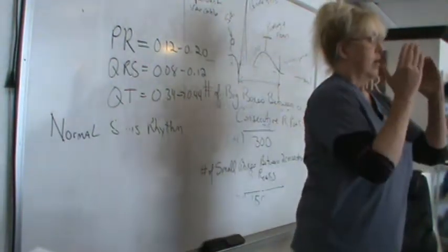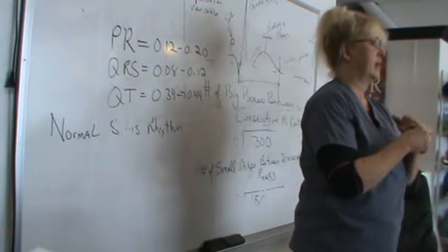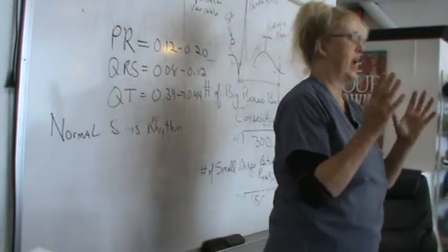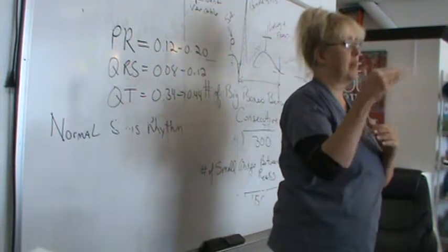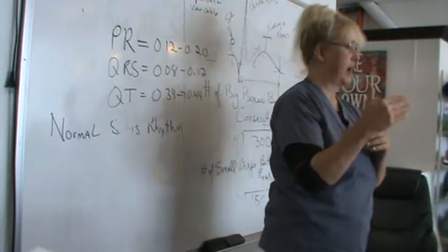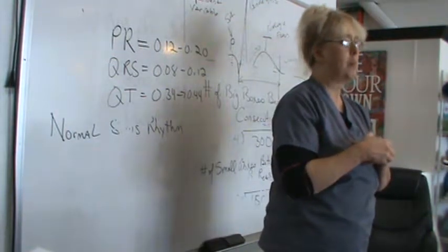Okay, so what happens when you're in front of a cardiac monitor and you're a telemetry tech, but you're watching like 30 different people, which is way too much. There has to be a limit as to how many people or heart monitors is safe to watch, and obviously 30 is over the limit.